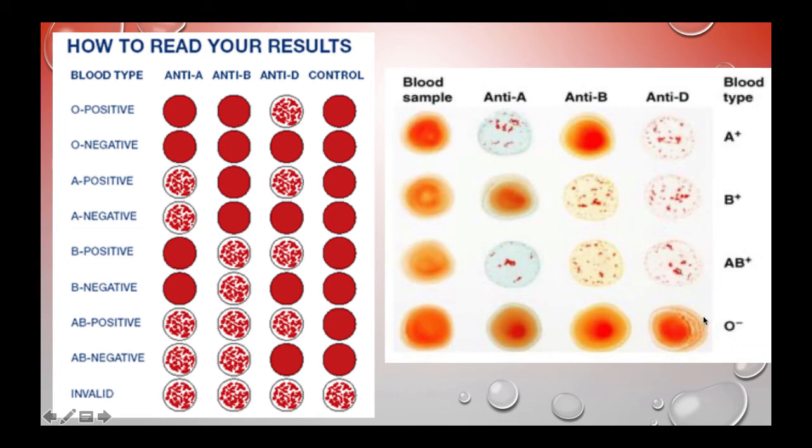And here, if you have no agglutination whatsoever, you are truly being called by all of the blood banks because you are O negative, which is pretty rare. If you are O negative, then you don't produce the A antigens, the B antigens, or the Rh antigens. So you produce none of the antigens. And again, you truly are the ultimate universal donor.